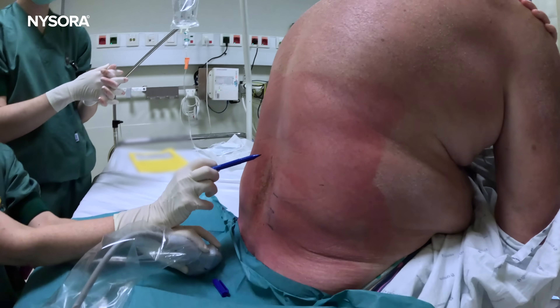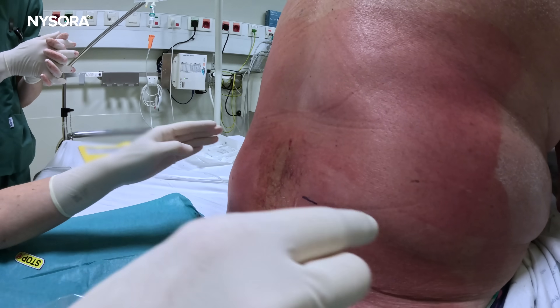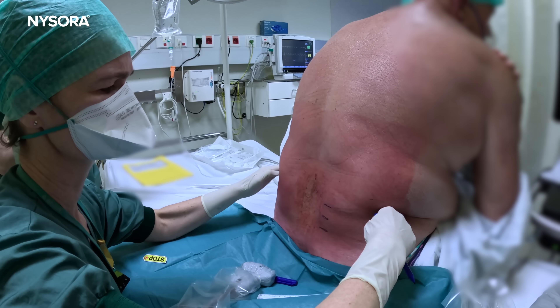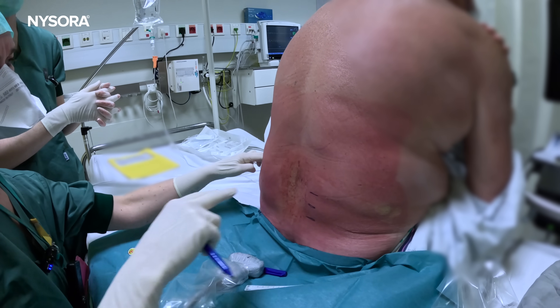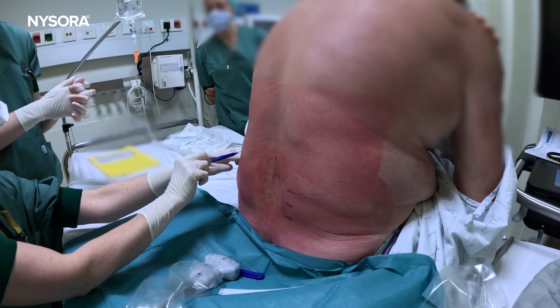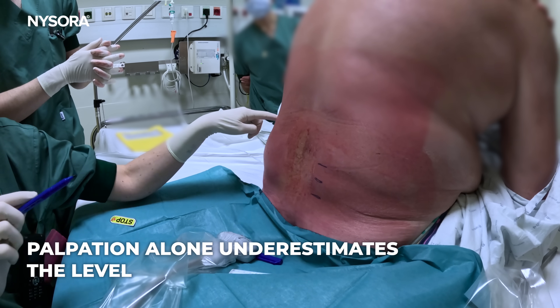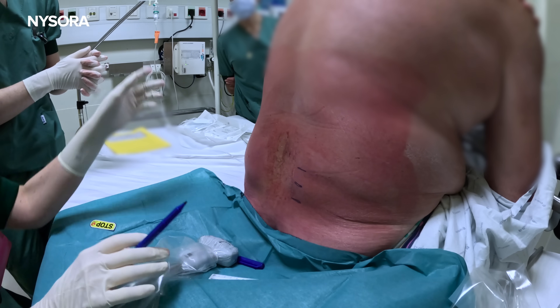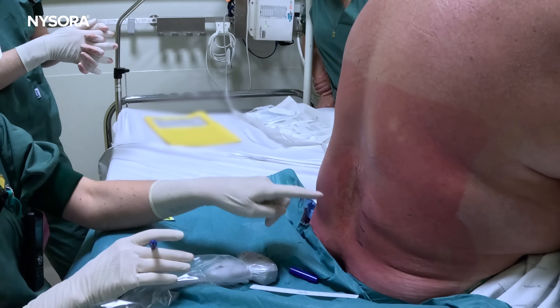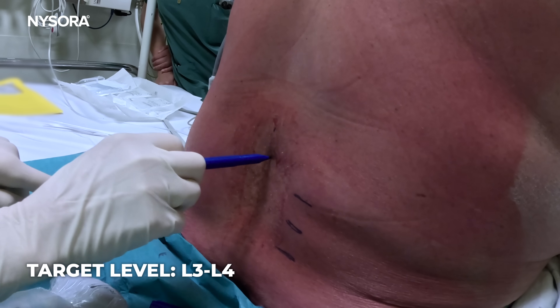The level he was previously using was a bit higher. If we physically try to push and feel the iliac crest, it appears to be somewhere here — but if I push here, the iliac crest is actually under my fingers. So that would have been here, and the level that was punctured was quite higher. So let's reposition the patient and have him sit straight. This is going to be the level we want to do our puncture, and we've already determined the midline.